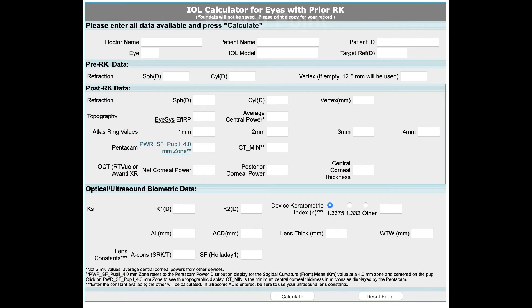Here you first fill in all the preliminary data required for patient identification. Then, if the decision is already taken as to which IOL model you want to use, you fill that in, and then you come to the target refraction.